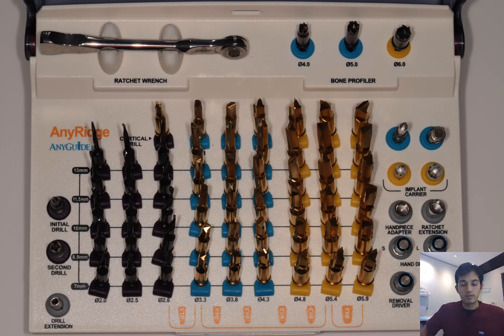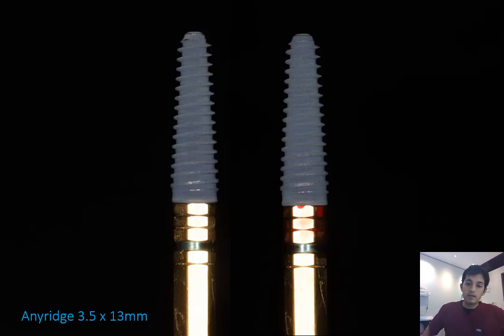So those of you watching this, even if you're not placing any Megagen implants, this is a great kit to use for guided surgery, having the sleeves built into the drills. You can see that in all the different things here. So regardless of the implant system you're using, you can adapt this kit into your workflow, and it works really well for that. So we create our osteotomy through the surgical guide.